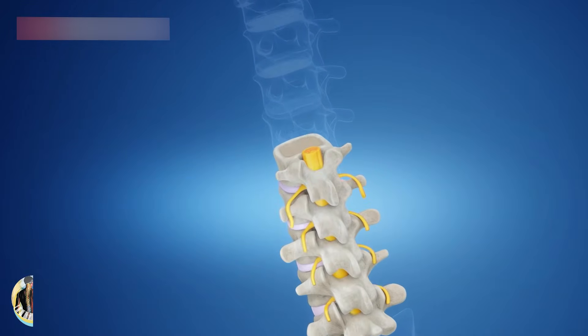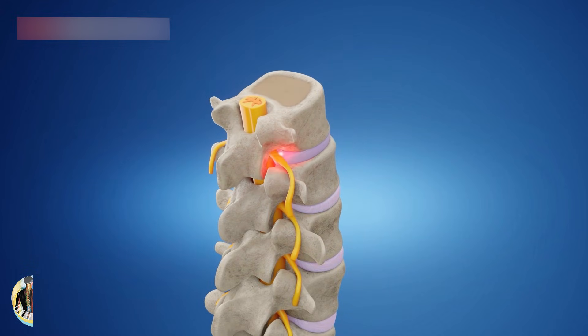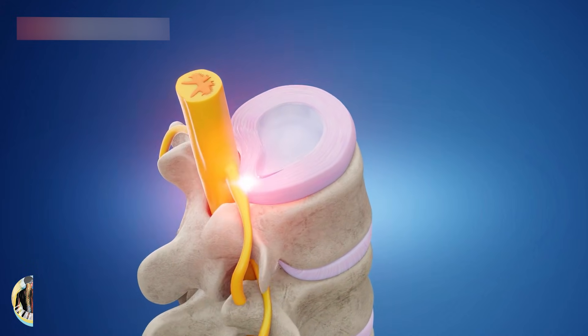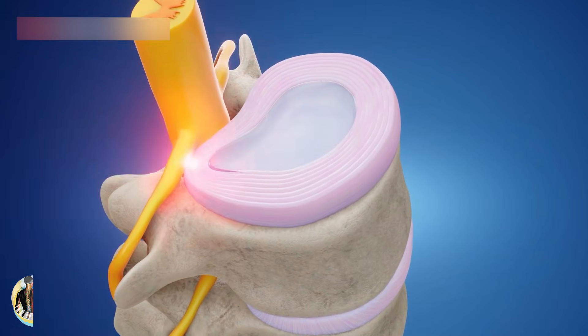To start, the skin of your back is numbed. The doctor inserts a needle through the numbed skin. A video x-ray device called a fluoroscope helps guide the needle into your bulging disc. A guide wire is passed through the needle, and the needle is removed.